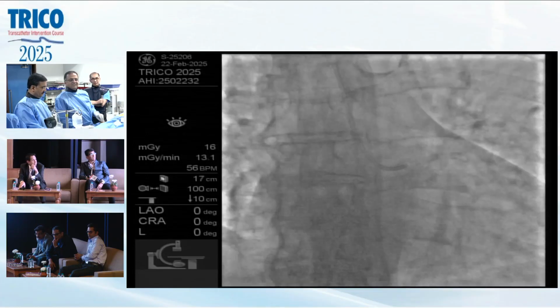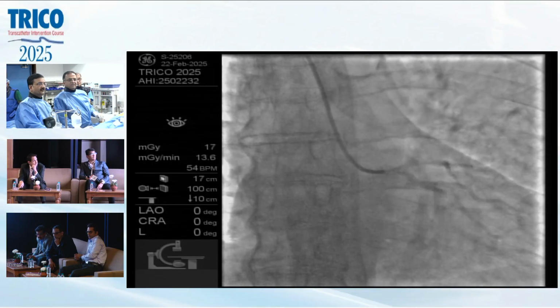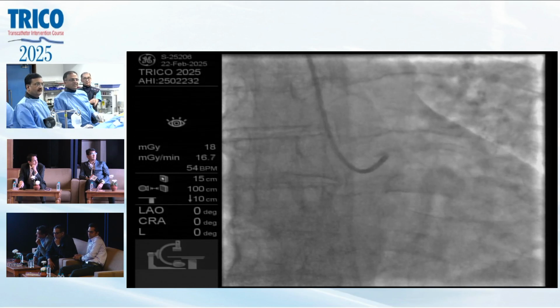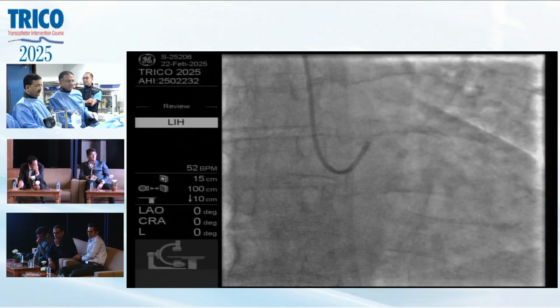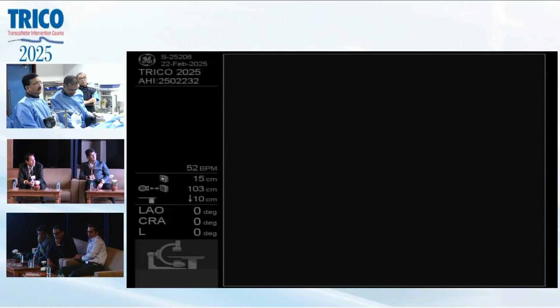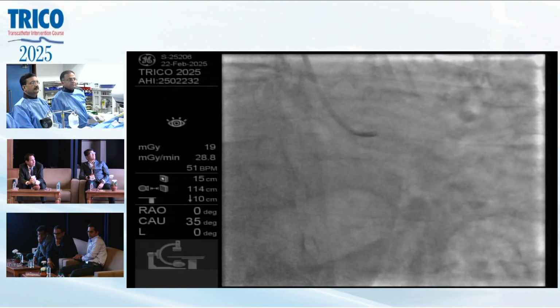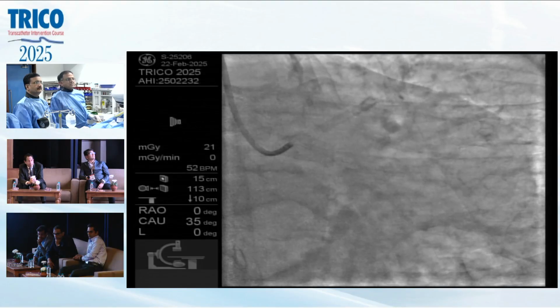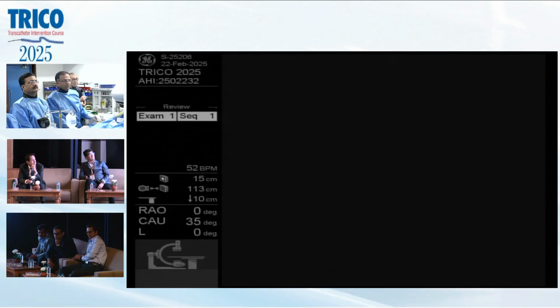Pressure down. Yes, fine. The pressure tracing is good. I'll make it a little steeper and a little more out. Good. Do we want to work in the caudal? Yes. We take a couple of shots. Ready? Yes. It really flows down to cranial.